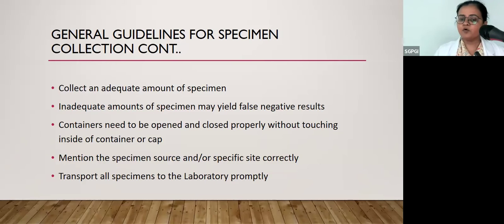Containers need to be opened and closed properly without touching the inside of the container or the cap. Mention the specimen source or specific site correctly. Transport all the specimens to the laboratory promptly.